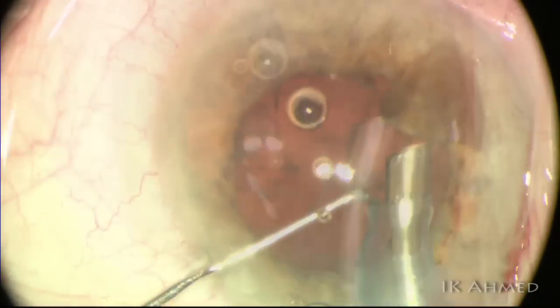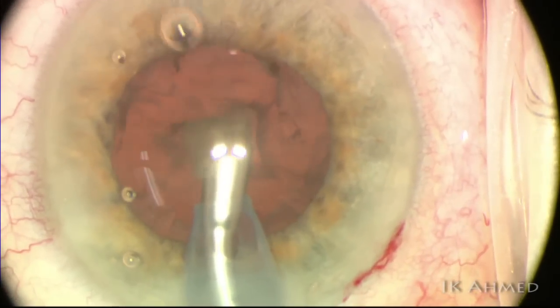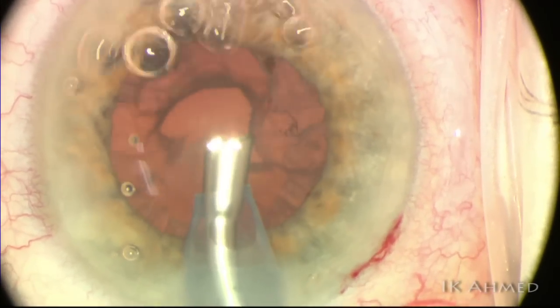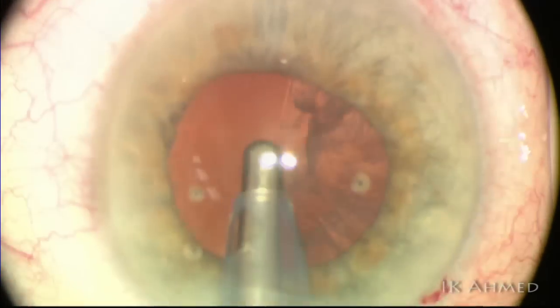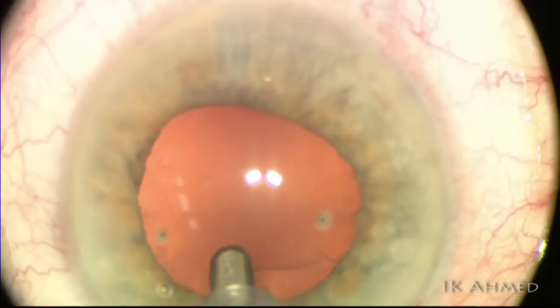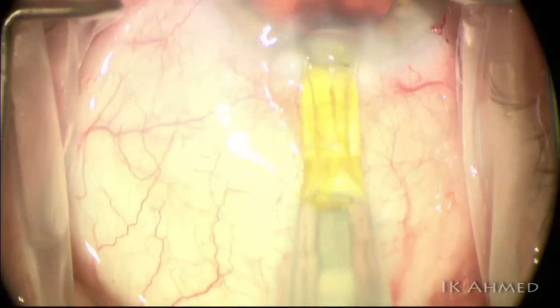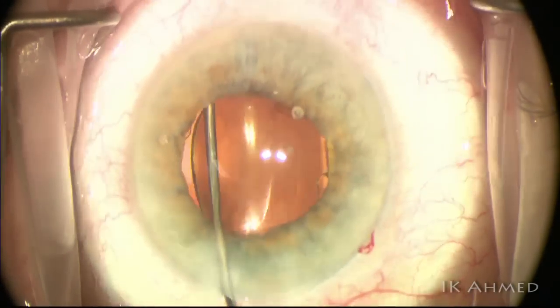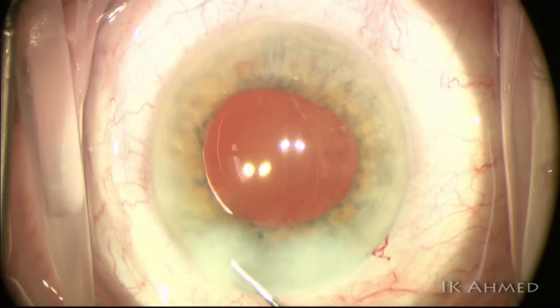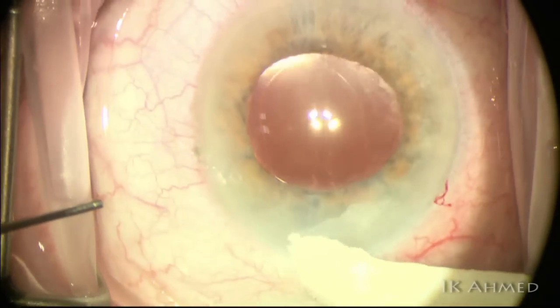We do need to apply enough phaco power in these cases to prevent tip blockage — another pearl for dense cataracts. To summarize: use the right capsular dye technique, recognize capsular splitting phenomena, create a deep groove in the center leaving a nasal shell to chop into, use the right phaco tip and power modulation, and make effective use of dispersive, cohesive, and superviscous cohesive agents. These strategies are all helpful in managing dense black cataracts.